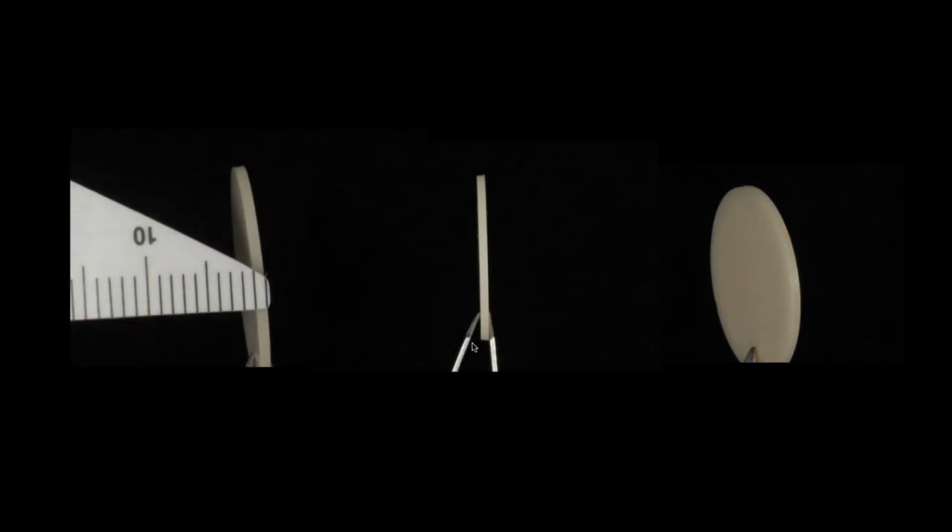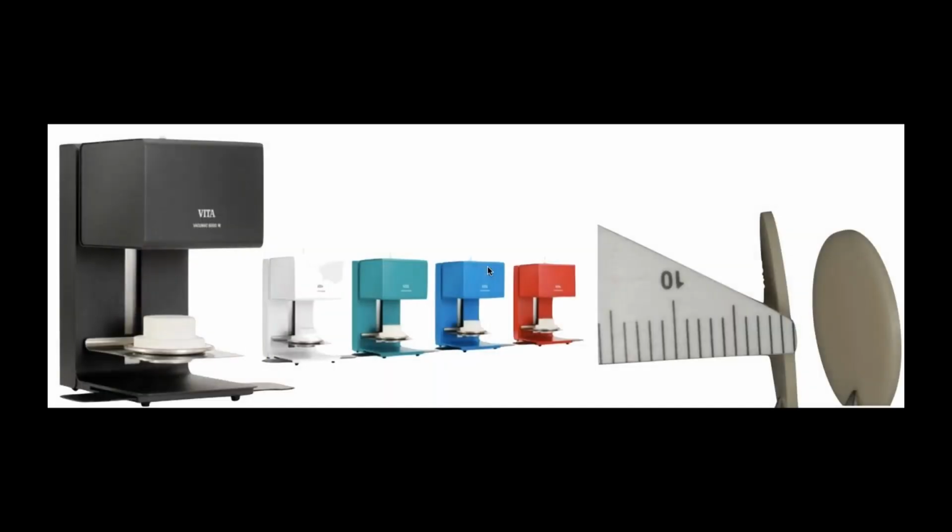A lot of it. And actually, I would tell you that sometimes it's about 60 to 70%, depending on which material you're using, which company's material you're using, and how you fire it, because that plays a role if you over or under fire the material. But based on that concept of working with about 1 millimeter of thickness, and by the way, I want to be clear, the firing parameter is so critical.